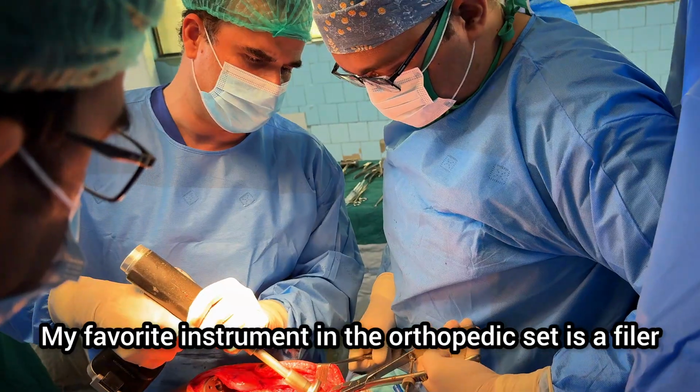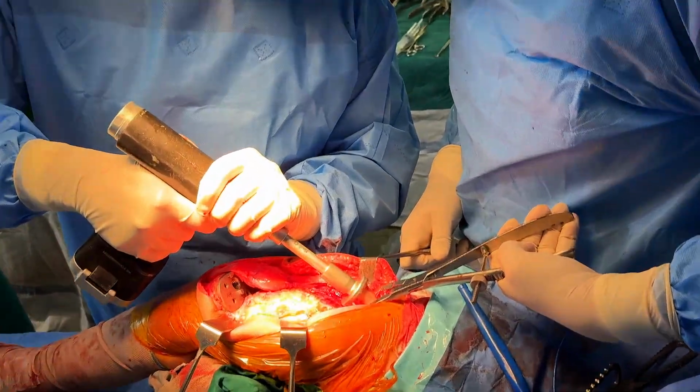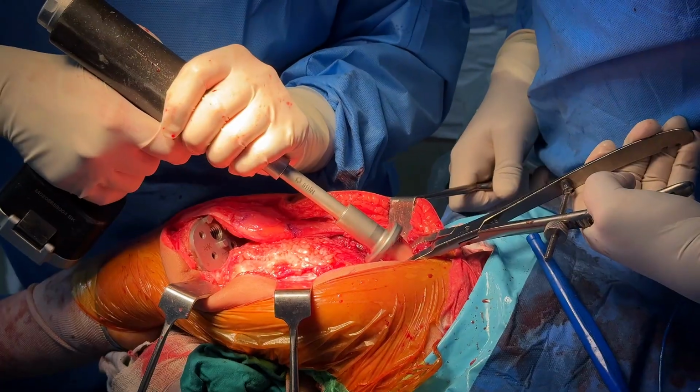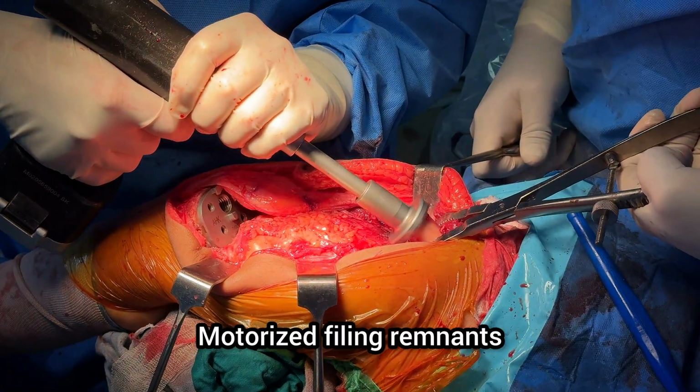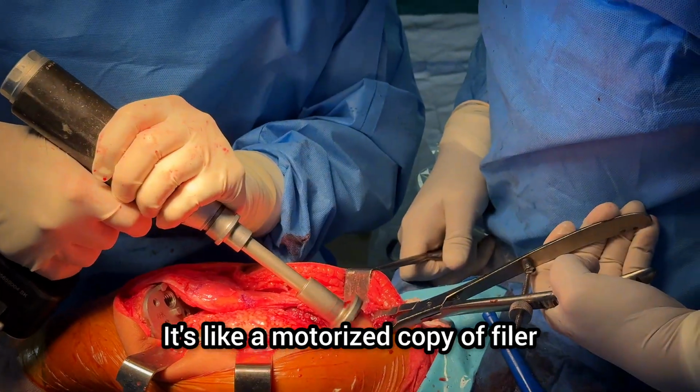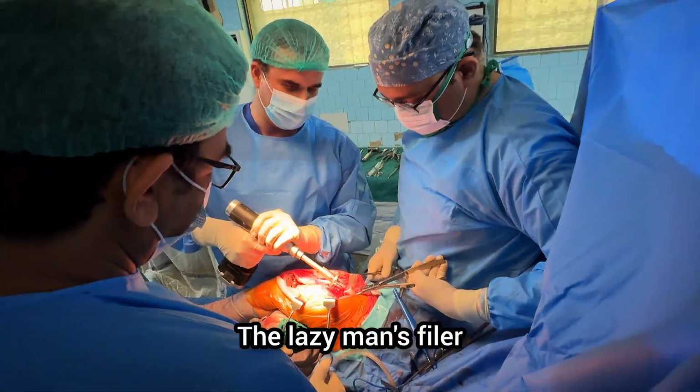My favorite instrument in the orthopedic set is a filer. I call it the tax filer. And this is the filing remnants. Motorized copy of a filer. The lazy man's filer.